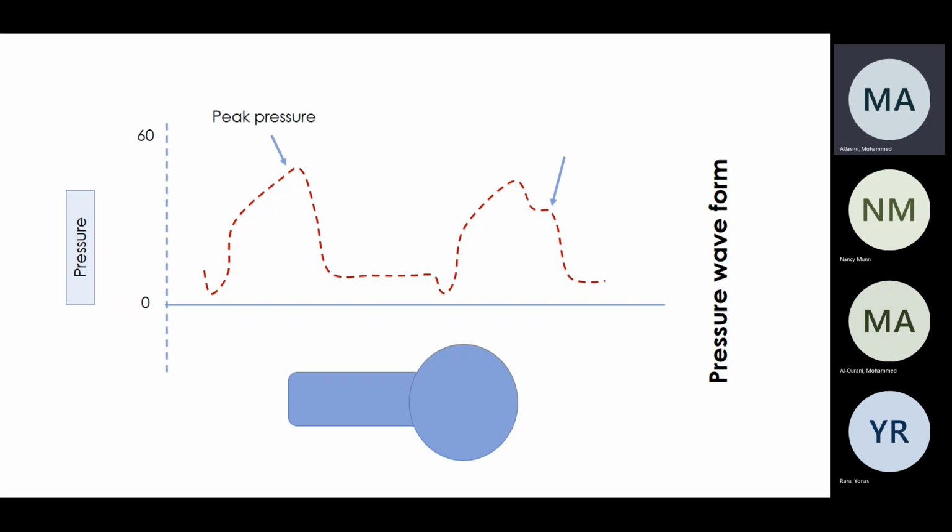Even if there's no air moving, yes, we have surfactant in our alveoli and a little bit of pressure that keeps the airway open. But there is a pressure on the mechanical ventilation that will keep the alveoli open during that end of inspiration, which is the plateau pressure. Is that right? So the plateau pressure will give us a clue about the static pressures, not the dynamic pressure. Okay. And that's to keep the alveoli open at inspiration.